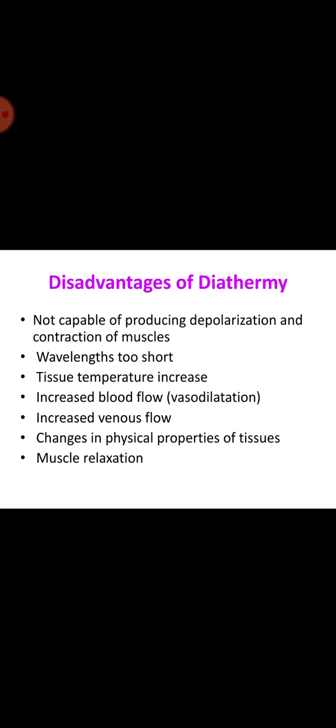The machines that achieve this by combining two waveforms consist of an active and a reference electrode, that is, an indifferent electrode. Biological tissue can only be cut when the voltage between the cutting electrode and the tissue to be cut is high enough to produce electric arcs between them. The temperature produced at the points where the electric arcs contact the tissue, like microscopic flashes of lightning, is so high that the tissue is immediately evaporated or burned away.